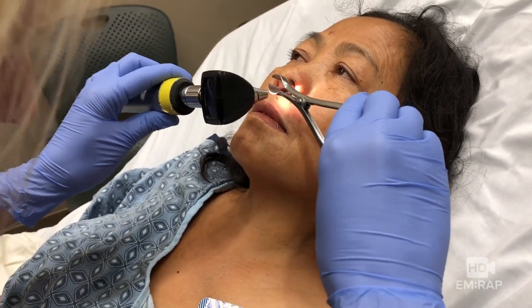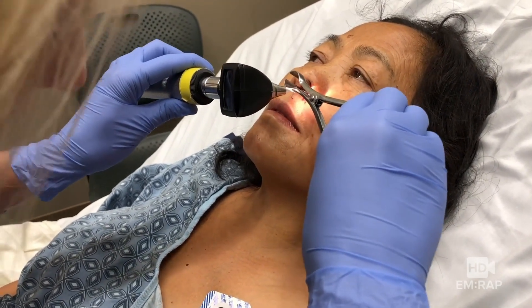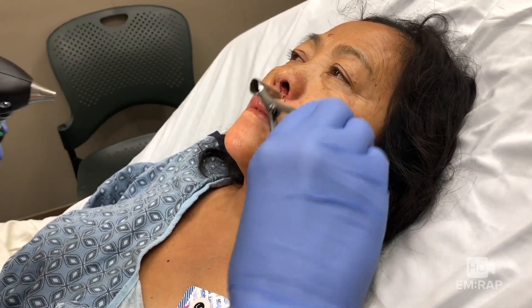We gently remove the pack, re-examine her, observe her for a little bit, and then she's good to go home. Of course some patients re-bleed and need to come back, just like with anything — but this is pretty darn effective and it's a whole lot better than going home with a tampon in your face.